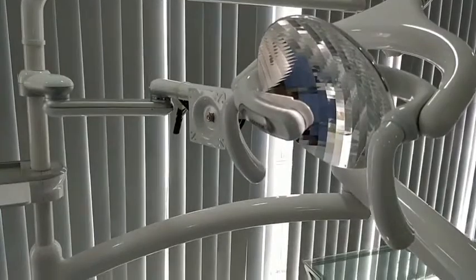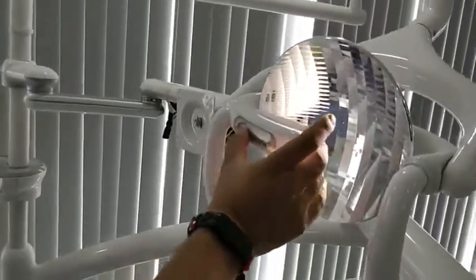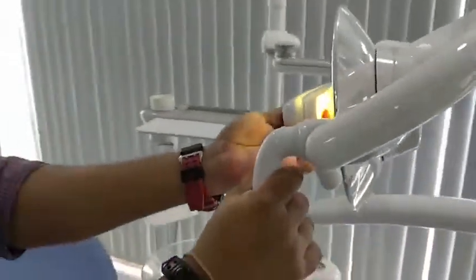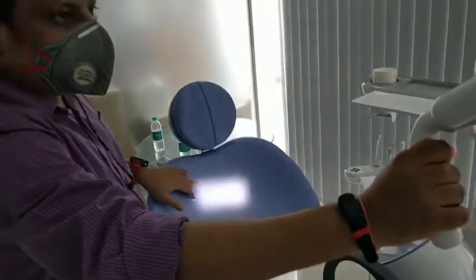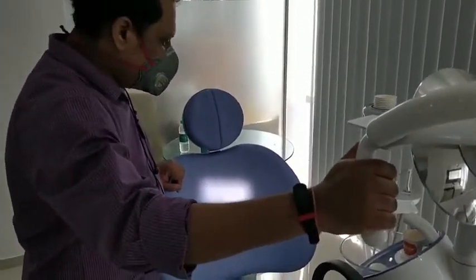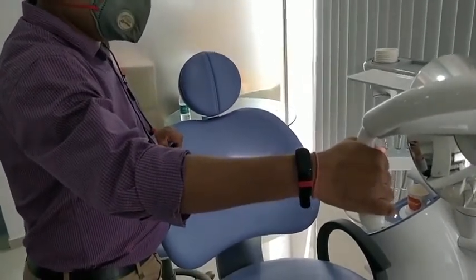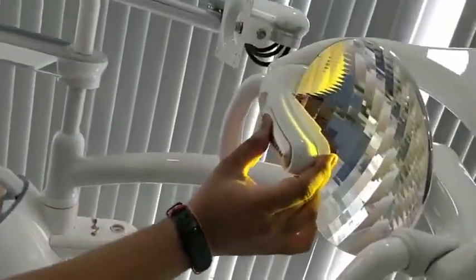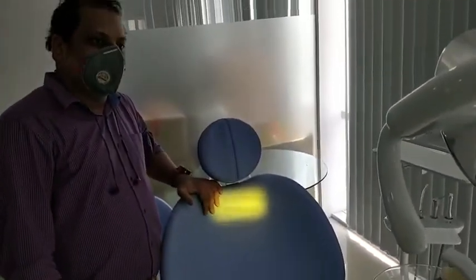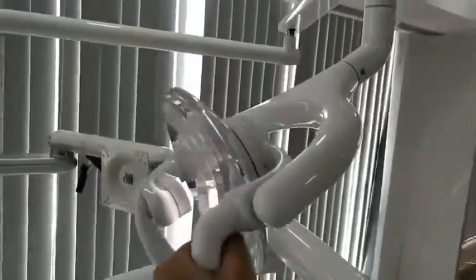Since dentists work long hours looking into patients' mouths, yellow light can be stressful — white light reduces that stress. A unique feature is a slider that changes the light color. For composite restorations, the blue light from the overhead lamp can cause premature curing, so sliding the panel changes it to yellow light, which will not cure composite prematurely.